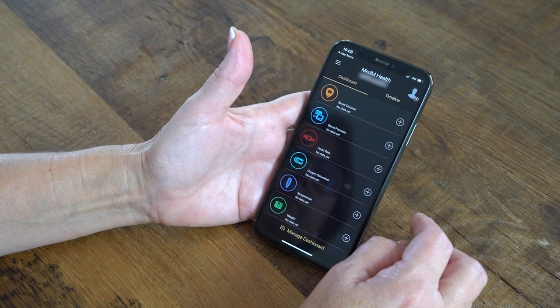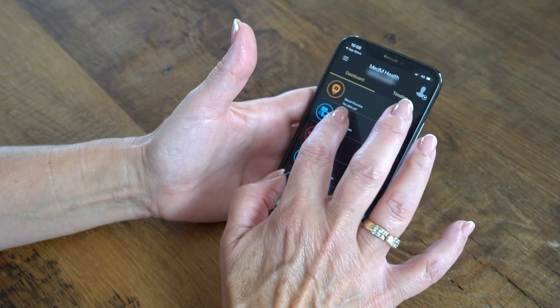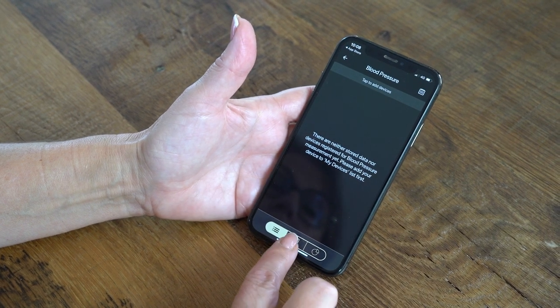The BPM617 can also be used with the MedM Health app to automatically sync readings. In this instruction video, we will follow the steps for an iOS device, but they are similar for an Android.